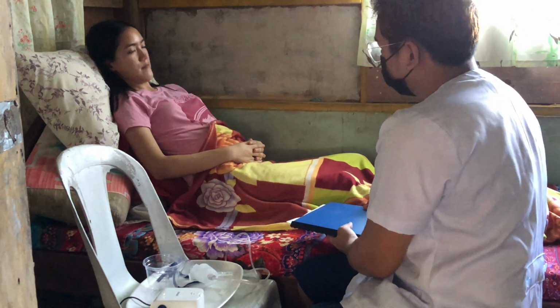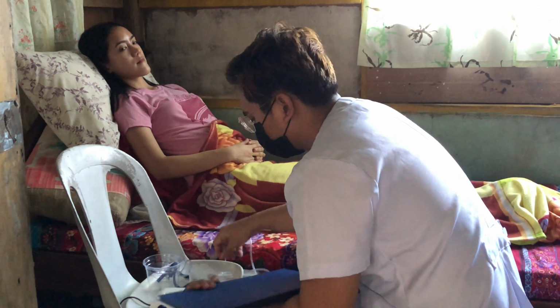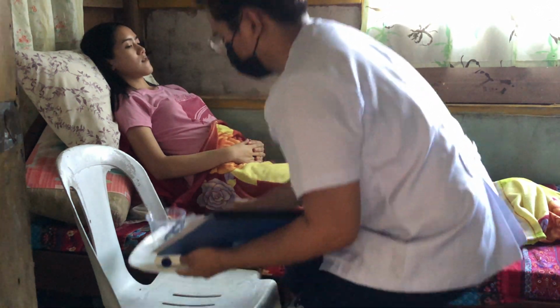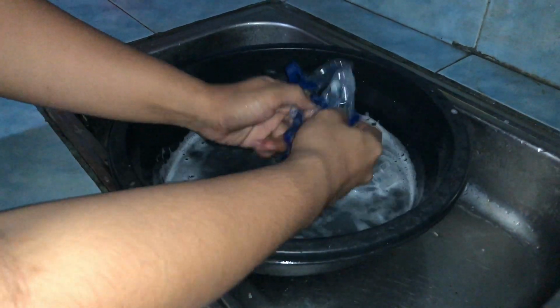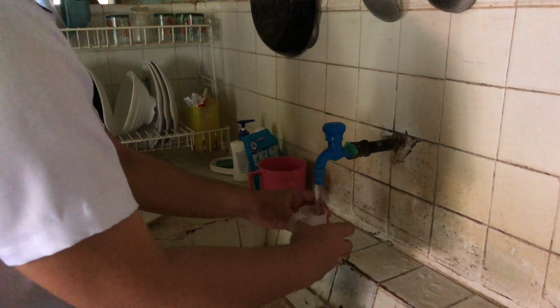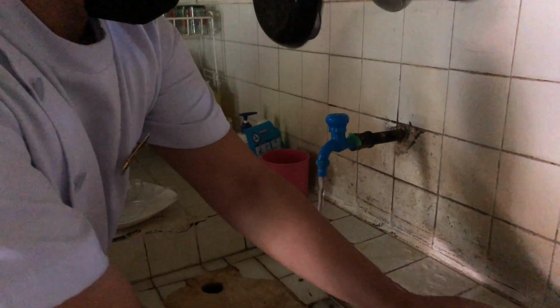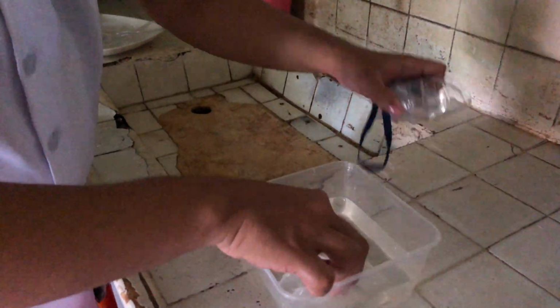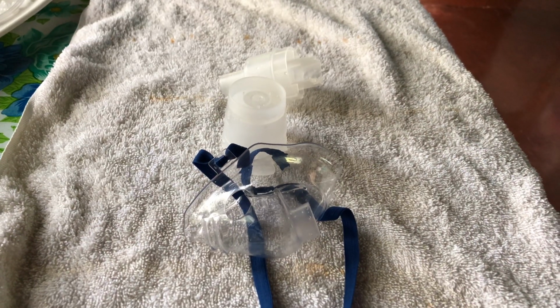Ensure that the patient is left feeling as comfortable as possible. Bronchospasm is further reduced if the patient is relaxed and reassured. Wash and dry the nebulizer, tubing, and mask or mouthpiece with warm, soapy water. Proper cleaning decreases the possibility of pathogens entering the client's respiratory tract.